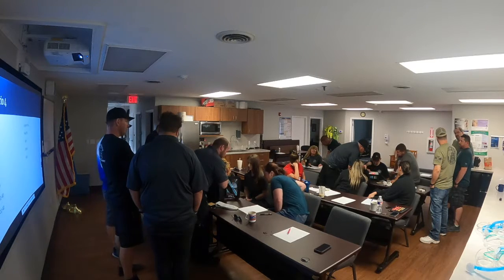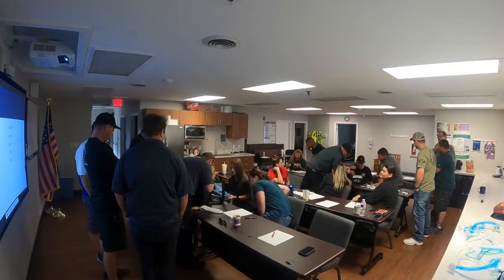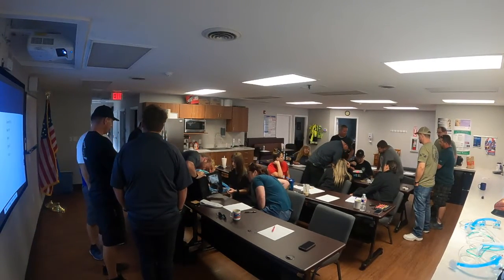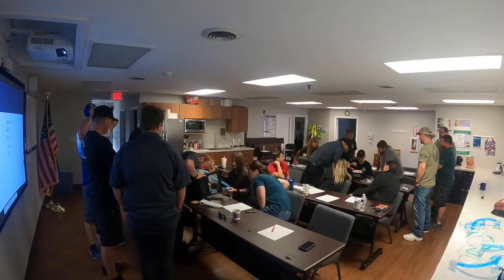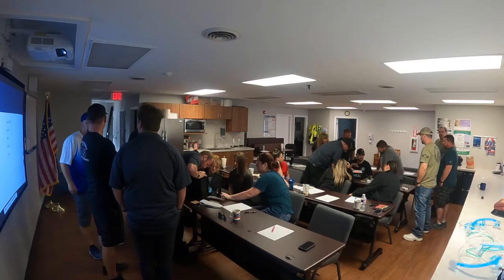We should see the high pressure alarm. Just push that button and stop.